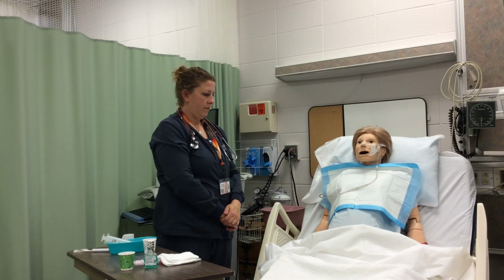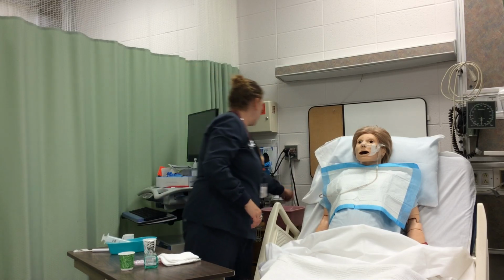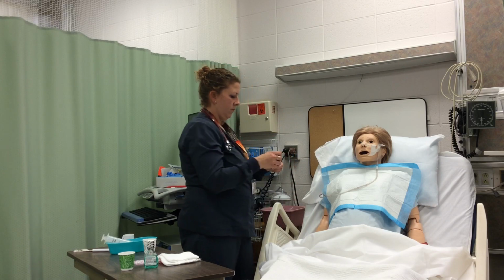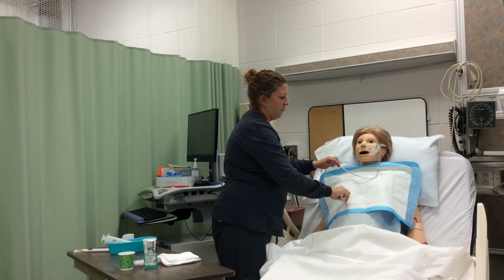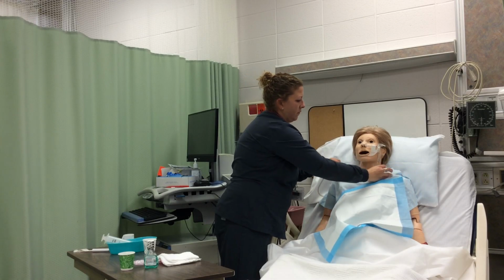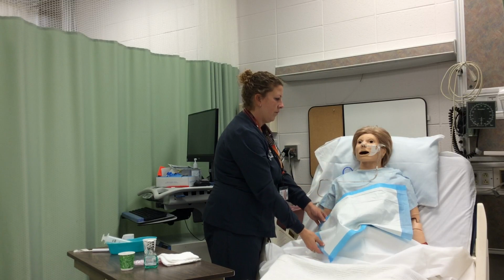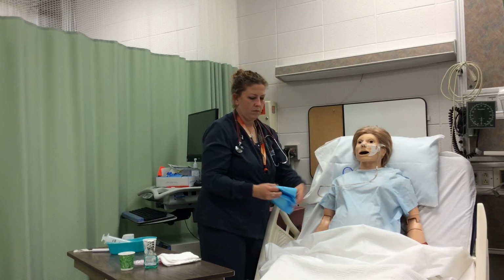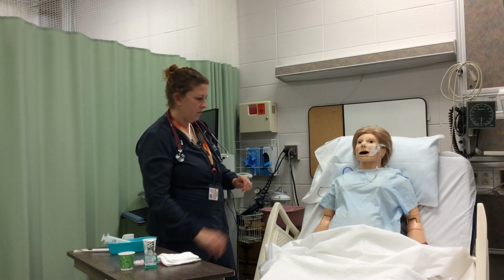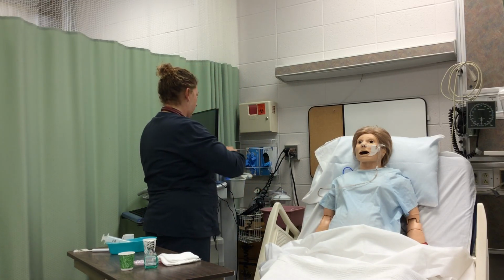Fasten the end of the NG tube to the patient's gown using a clip or piece of tape. Do not use safety pins to pin the tube to the gown. Obtain a chest or abdominal x-ray to verify placement and do not use tube until placement is verified. Administer oral hygiene.